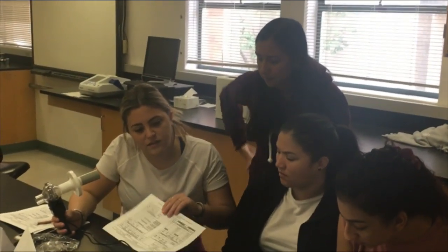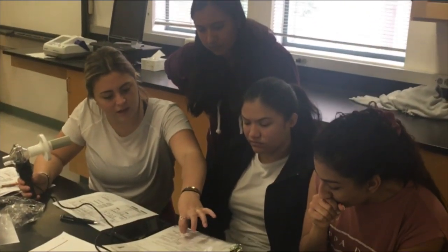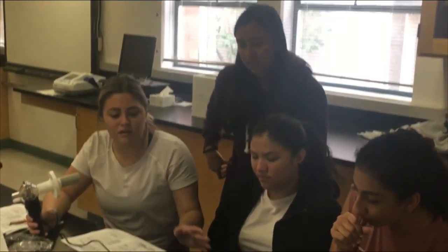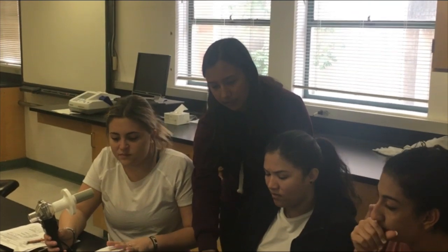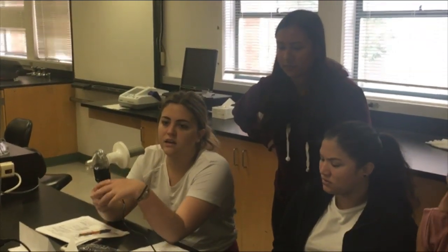Okay, and so for 19, we just do the normal one or the huge one. Okay. So it'll tell you to breathe normally and then breathe in deeply as much as possible, exhale as much as possible. Okay, so now it's 0 again.